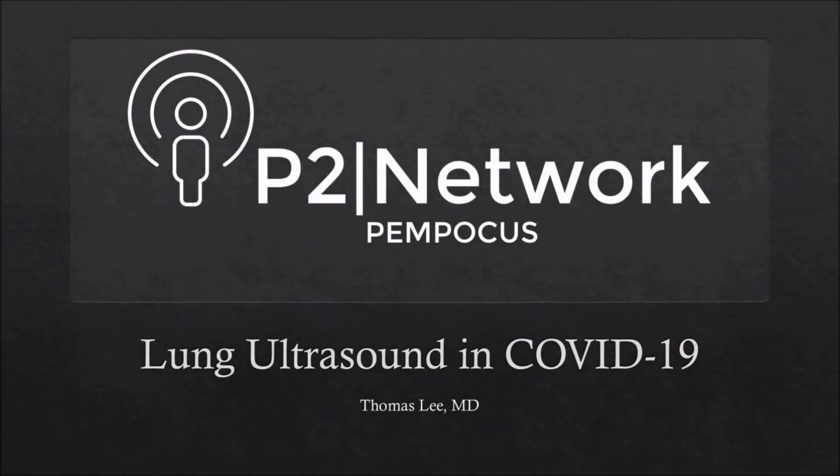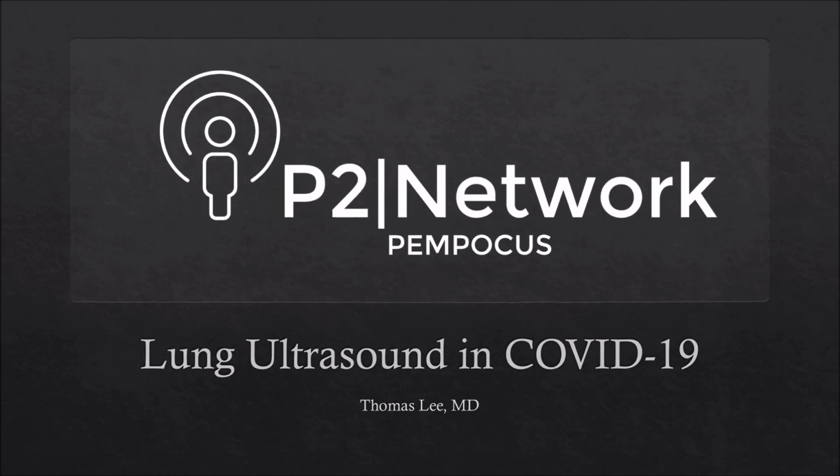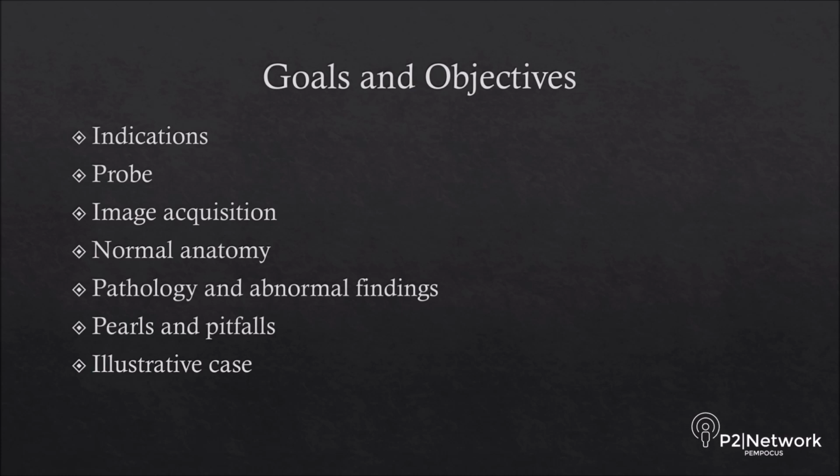Hello, my name is Thomas Lee, and I'll be talking about lung ultrasound and COVID-19. I'll go through some indications to use lung ultrasound in kids with COVID-19, which probes to use, how to acquire the images, what some normal anatomy looks like, as well as some pathological findings, the pearls and pitfalls and pros and cons, and we'll go through a case together.